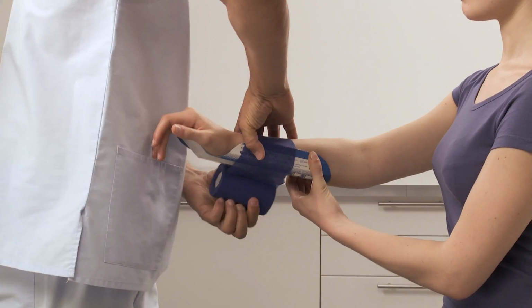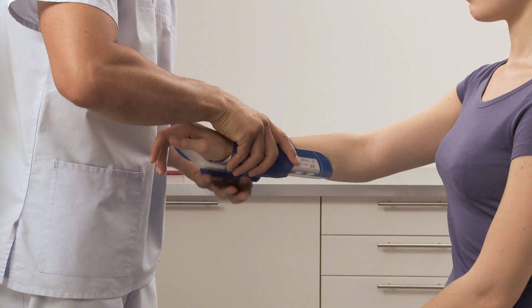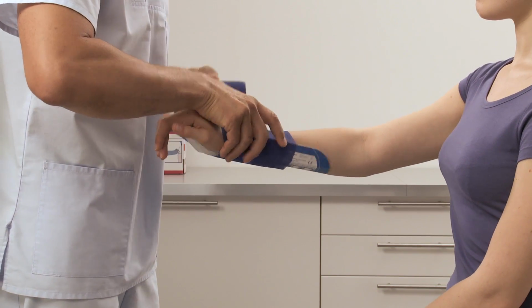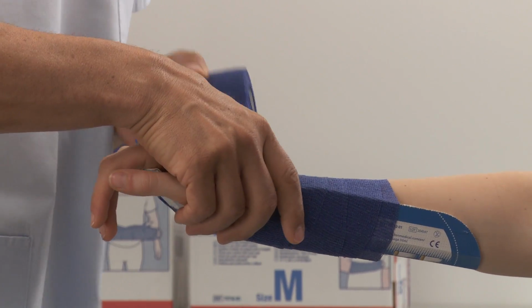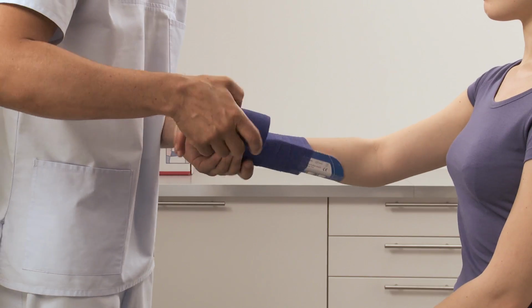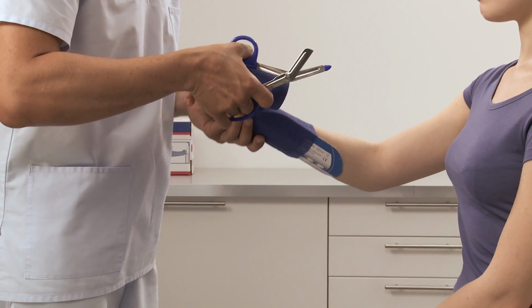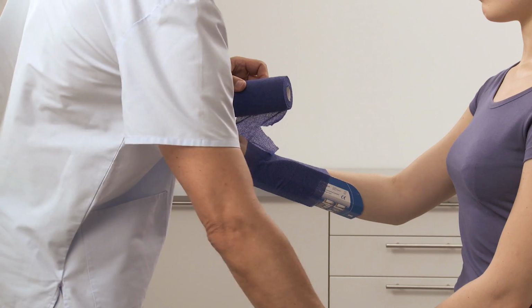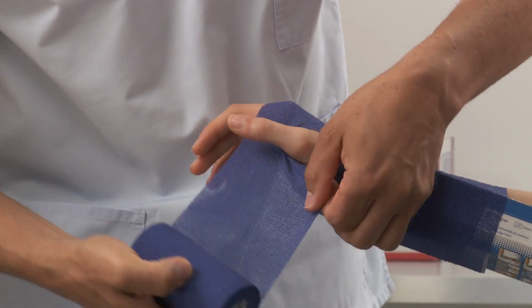You can customize the splint if needed. Secure with bandage or the hook and loop fasteners Delta-Xpress straps. In case you fix it with a bandage, start wrapping at the wrist joint. Fix the wrist and work up to the knuckles. Afterwards, wrap from distal to proximal with a 50% overlap of the bandage. While wrapping, ensure that the splint is kept in the correct position.